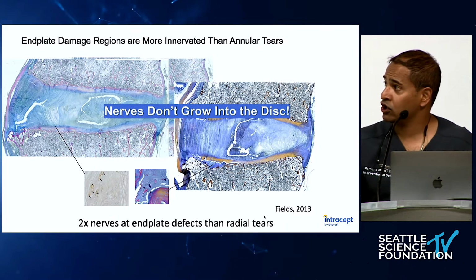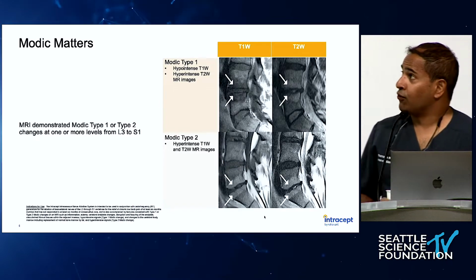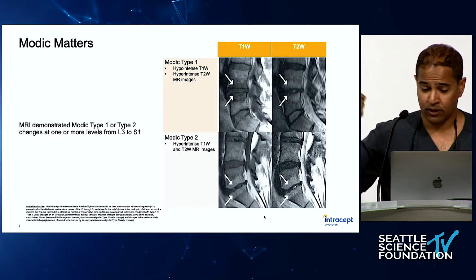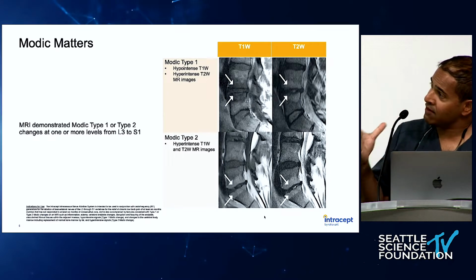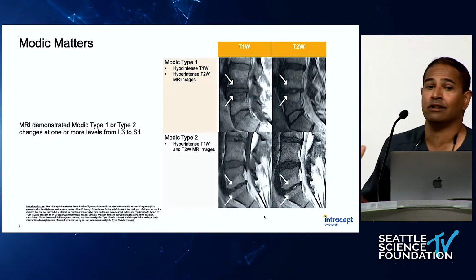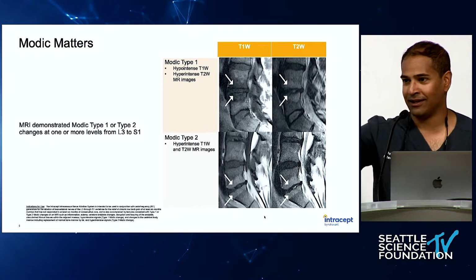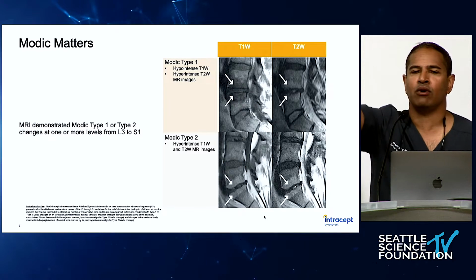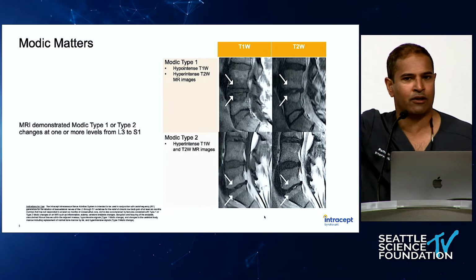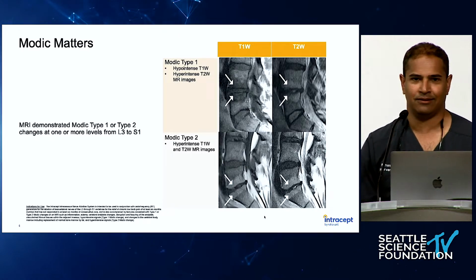It's really the innervation of the end plate that is stronger. So for years, Doug can give us the whole history of where Modic was, who he was, and all of that. But even though we knew what Modic was, it really didn't matter for many years, frankly. And when we did a ton of studies and likelihood ratios and odds ratios of, if we see this Modic, what does that mean as far as the patient's chronic low back pain? And we can cite all those studies, but in the end, it really didn't matter.